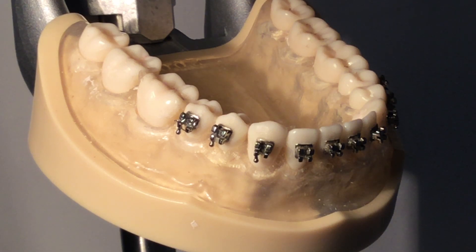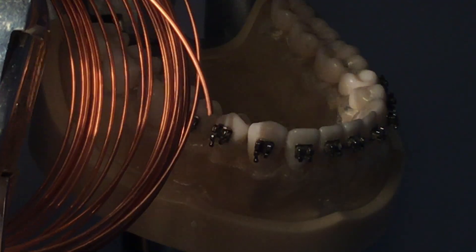Brass separator. Using wire cutters, cut one inch strip of wire.